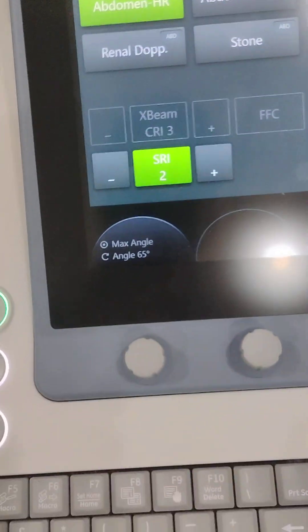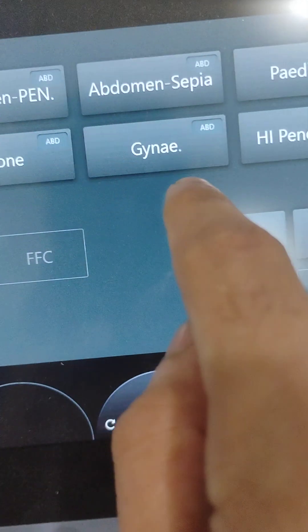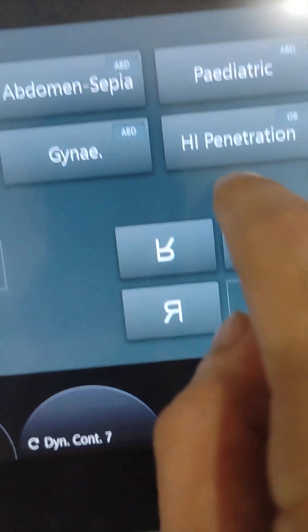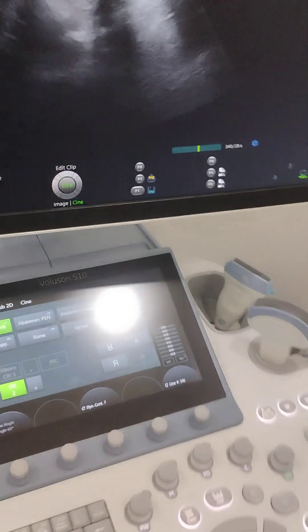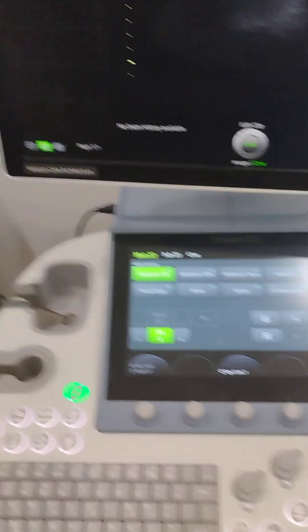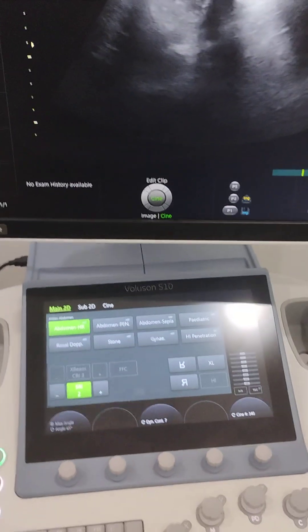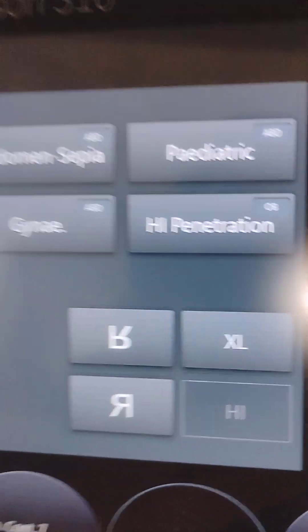There is 4D, abdomen, renal Doppler, abdomen, pediatric, and penetration modes. High penetration is something which is used when there is a finding in which the doctor has to look deeper into the body of a patient, so you use high penetration in that condition.